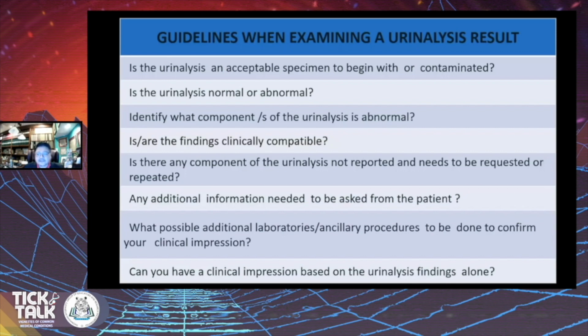Third, identify what component of the urinalysis is abnormal. Fourth, are the findings clinically compatible with the patient's presentation? Next, is there any component of the urinalysis not reported that needs to be requested or repeated?